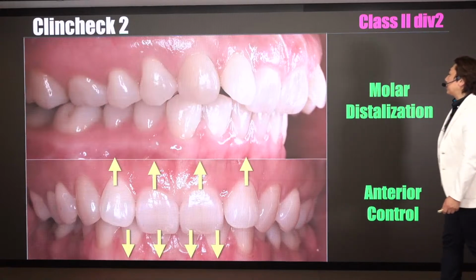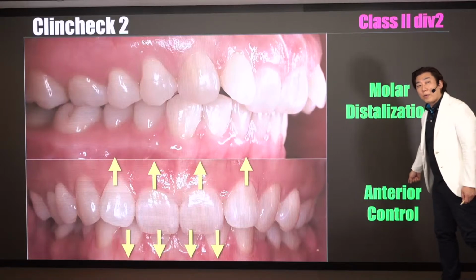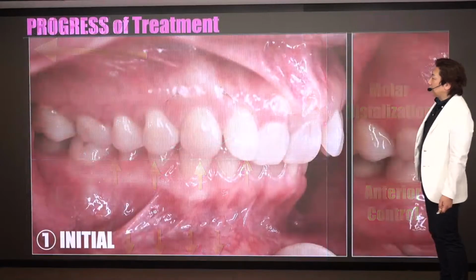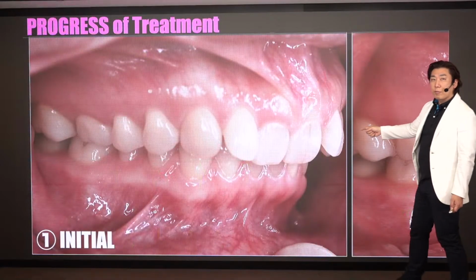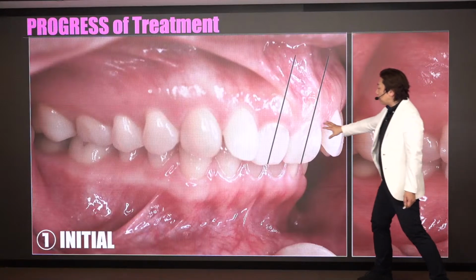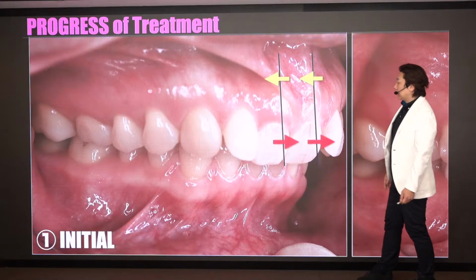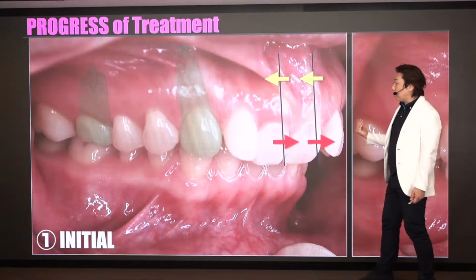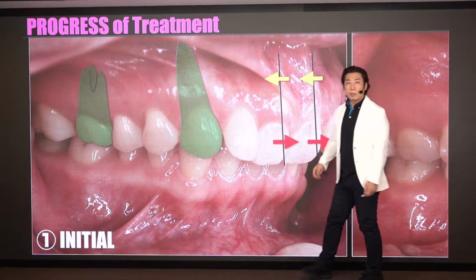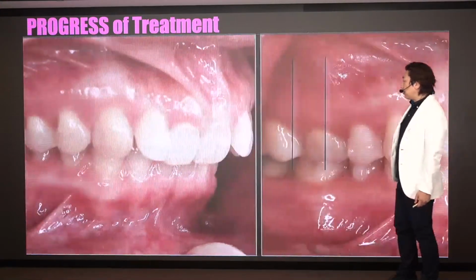This is the more distal initial situation. Then we started with anterior control first. This is the initial situation. We have to control the anterior axis first. This is my planning, you already know. This is the canine, and this is the first molar position. Definitely a class 2 relationship, upper and lower.